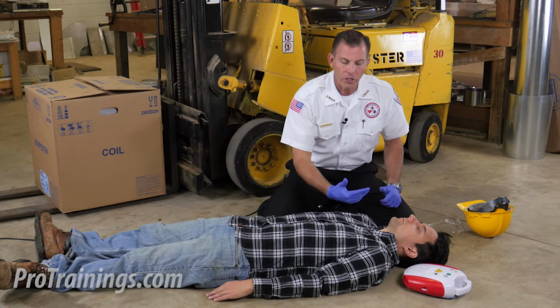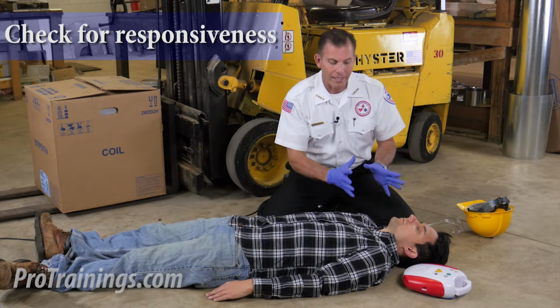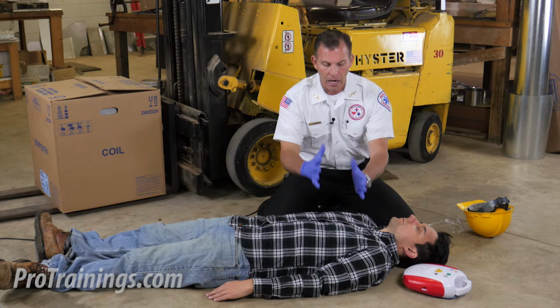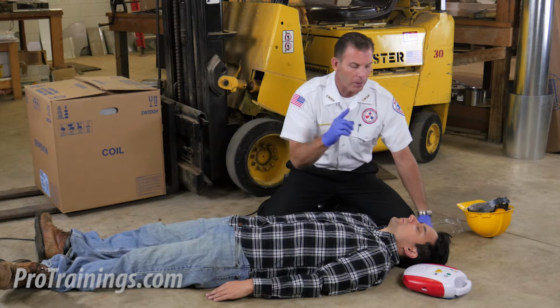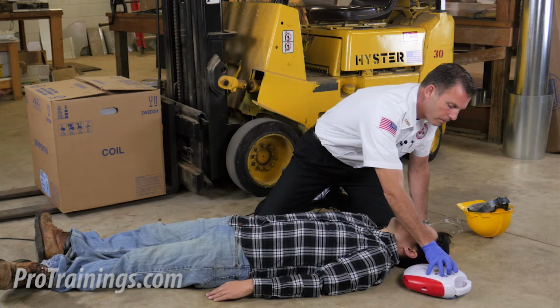So I know that the patient is unresponsive. I assess to see if they're moving, and I see that they're not breathing normally. If I didn't have the AED, I would go straight into CPR compressions until the AED arrives. But because I have an AED available, the first thing I'm going to do is turn it on.